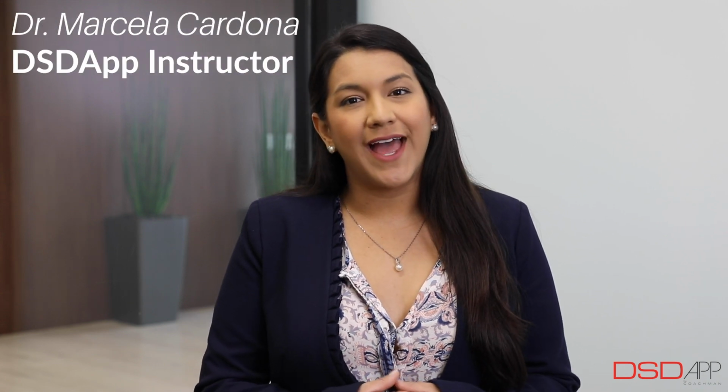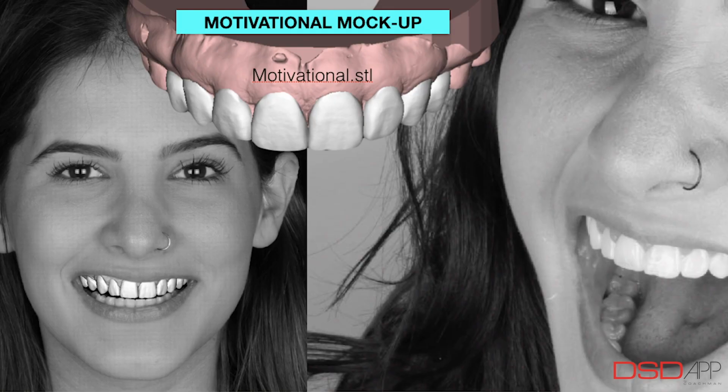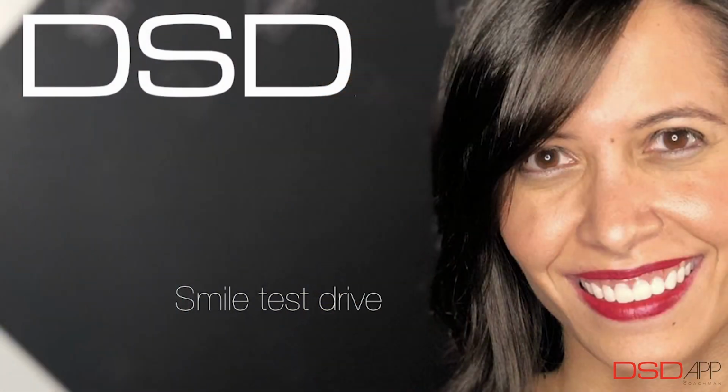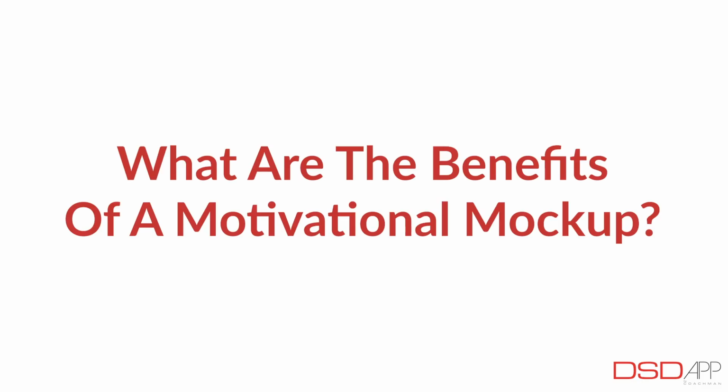My name is Marcela Cardona and today we will be talking about the motivational mock-up and test driving your patient's smile. What is a motivational mock-up? The motivational mock-up is the first time your patients are going to feel and see their new smile before treatment begins. This moment is very powerful as it will set the tone for the future treatment and it will excite and motivate your patients about their new smile. This is sort of like test driving their smile, just like you do when you test drive your car before buying it.